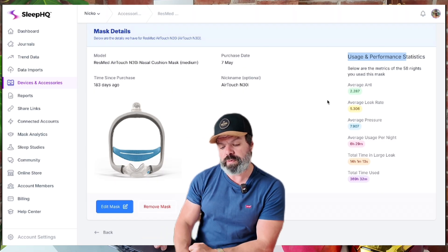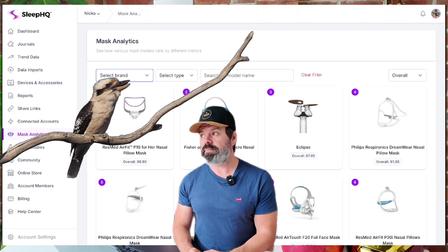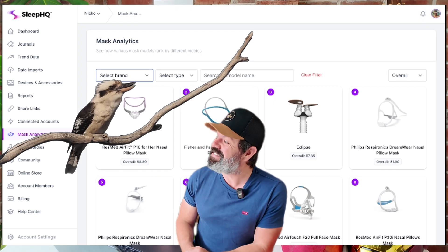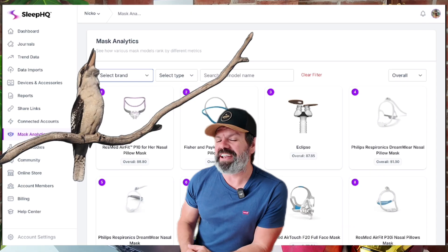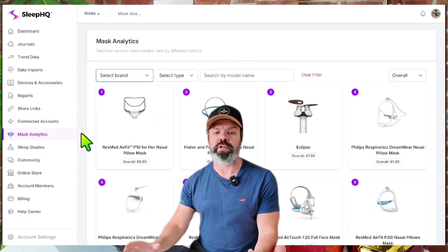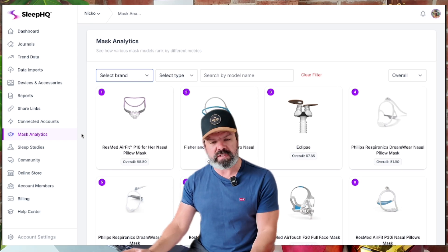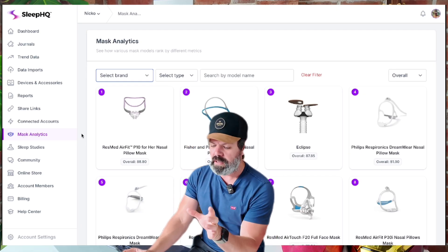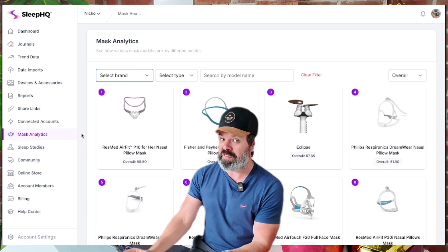But if we come across to the mask analytics menu here — a kookaburra is going nuts outside! — we can now compare all the different mask models across the entire Sleep HQ database. Thousands of members, millions upon millions of high-resolution mask data right here at your fingertips, and you can sort it however you like.